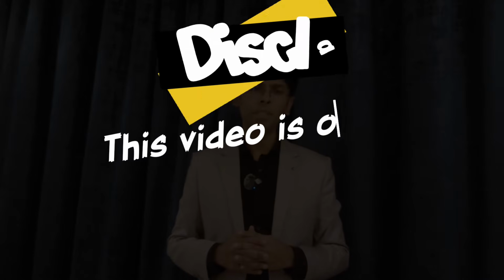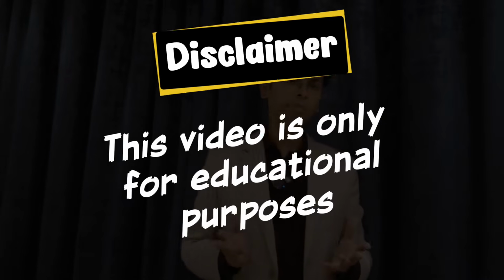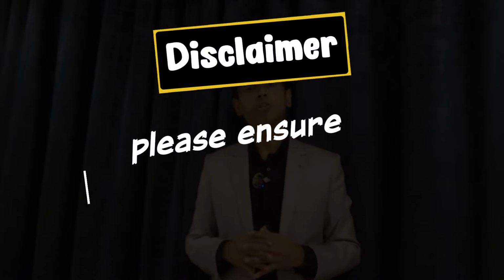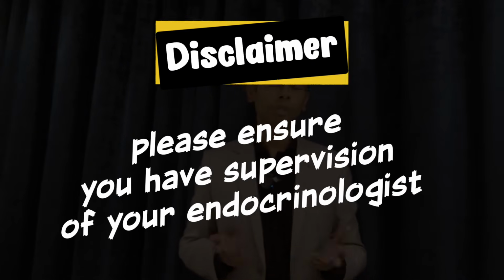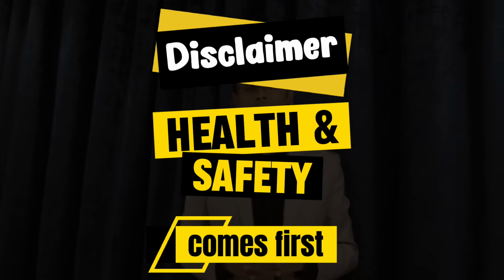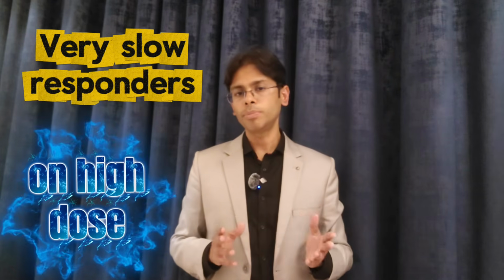Now remember, this is off-label and not the recommended way of using it, but we have used insulin pens before and also used Ozempic pens during the COVID times with good efficacy, and people have seen the results, as well as no safety concerns have been raised so far. If you are on a higher dose, which means that you are either responsive to 10 milligrams or 12.5 milligrams, then you may perhaps use the 15 milligram pen device to do the click counting mechanism.